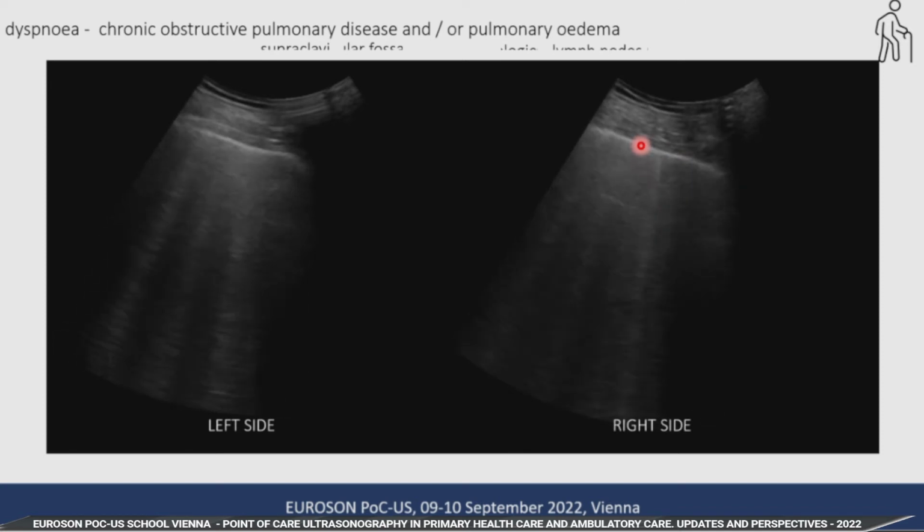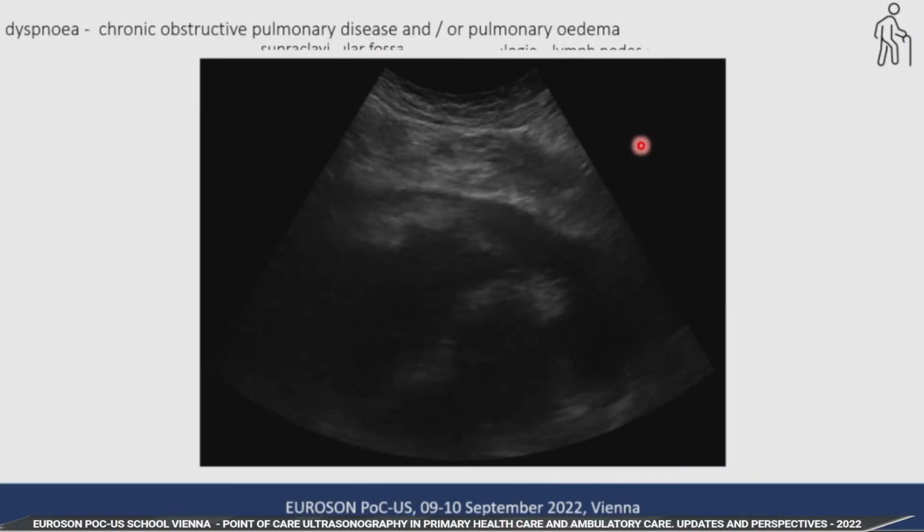Okay. Where will I put my probe? The heart. Is he sick or is he ill? Should he stay at home or go to the hospital? Simple. What do you do? It's fluid in the pericardium. He should go to the hospital, yeah? And this is how it actually works: you know where you are starting, you never know when you will be finishing.